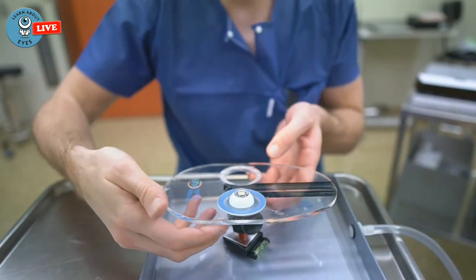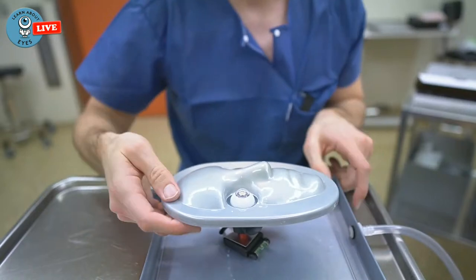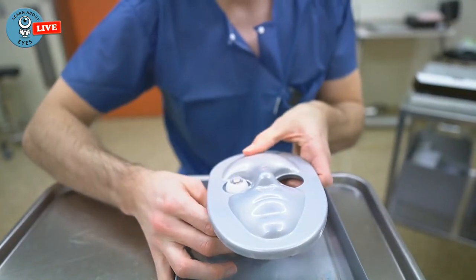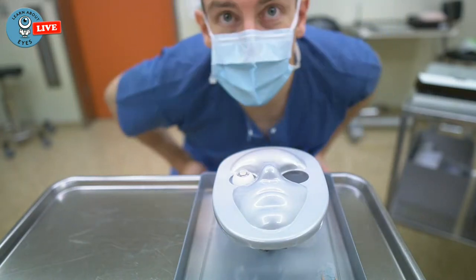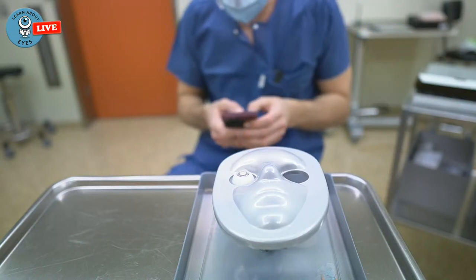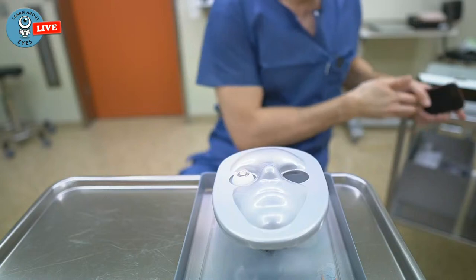Okay. I think we're almost set up here. And see, with the ball head, you can just adjust the patient's head, no problem. Okay, so let's set up the machine. Oh, by the way, I do need to take a picture of that. It looks really cool. Let's do that. Okay.